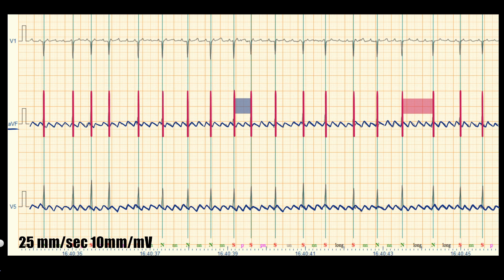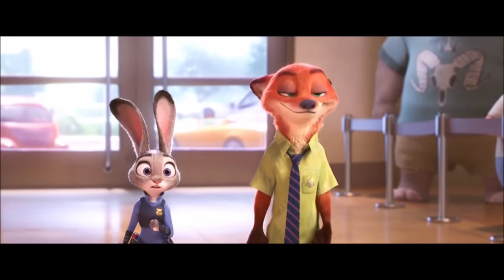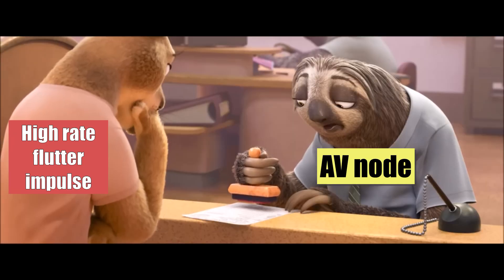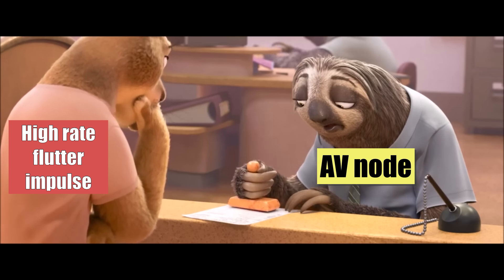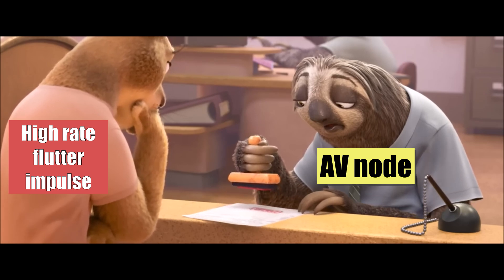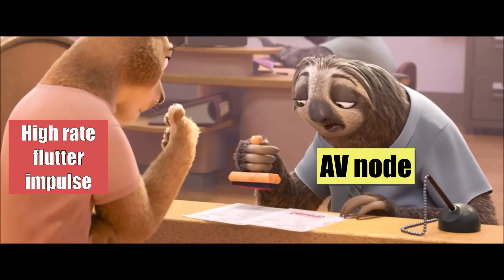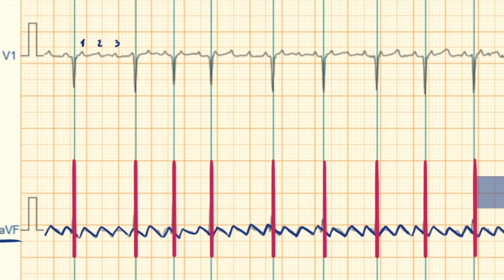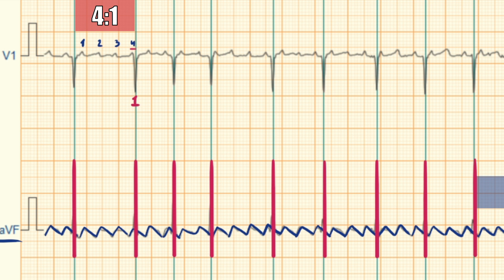Irregular rhythm in atrial flutter is caused by varying atrioventricular conduction. The AV node cannot conduct every flutter impulse because of its high rate. The AV node has a refractory period when it can't conduct any impulses, so some flutter impulses fall inside that refractory period. As a result, the ventricular rate is slower than the atrial rate. In V1 we see 4 atrial flutter waves and 1 QRS complex, so the conduction is 4 to 1.